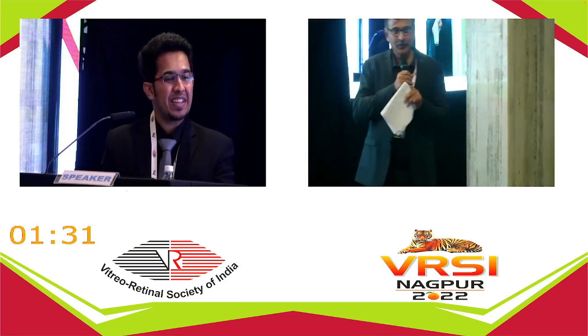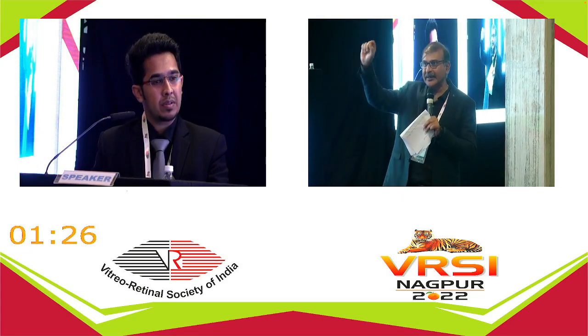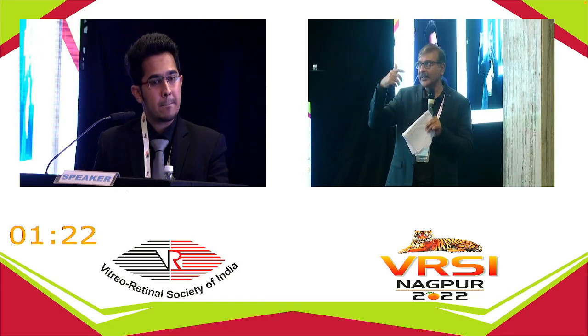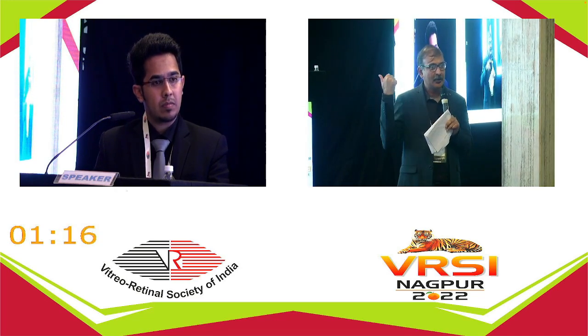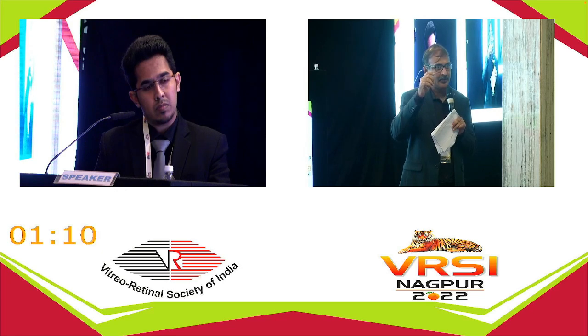I think there are two important points, like what Dr. Deshpande said, is the hematoma there, doing laser away from the area where the break has really happened, right? It's something which we have to think about. And the second point which you made, Dr. LG, I have a question for you. Not a thermal laser, right? Nd:YAG laser. You still feel that there will be some amount of chorioretinal adhesion that would have happened because of the impact?